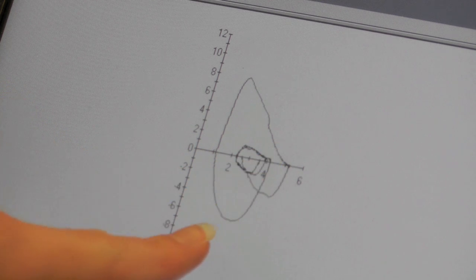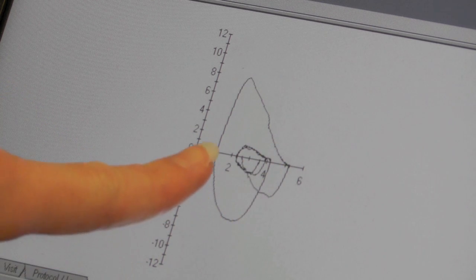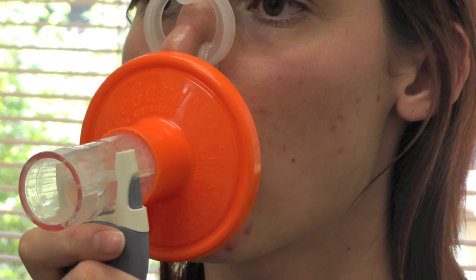You can take your nose peg off and relax. We test the amount of air that's going into the lungs and compare that with the amount of air that's coming out of the lungs, and from that, doctors can actually determine whether there's a problem with someone's lung function. We've asked her to take a nice, deep, sharp breath in, which is this loop here, and once she's blasting out, it comes around this way.